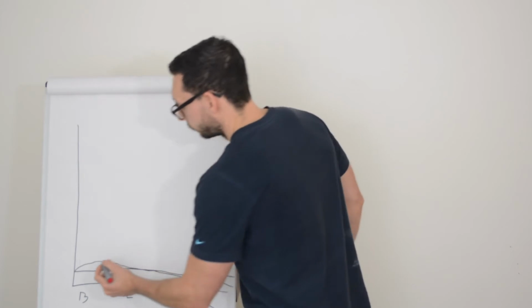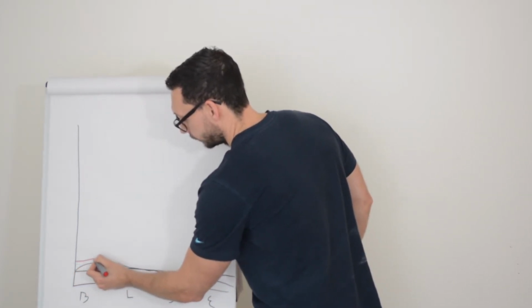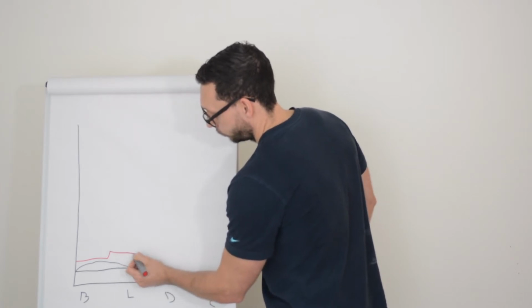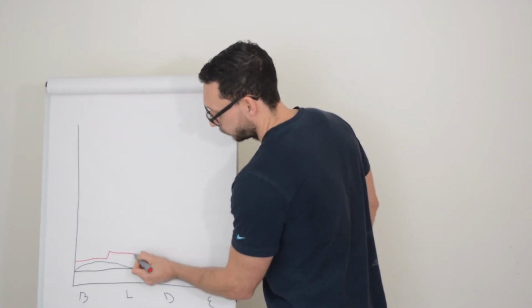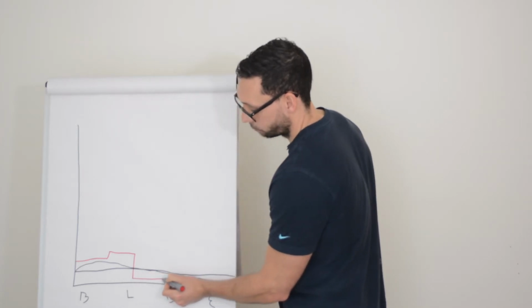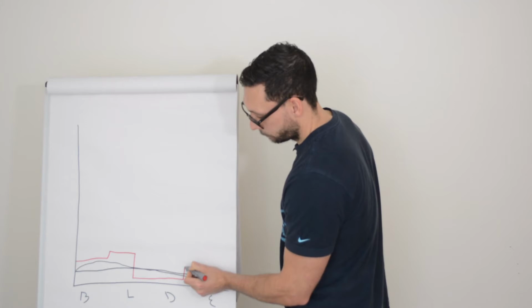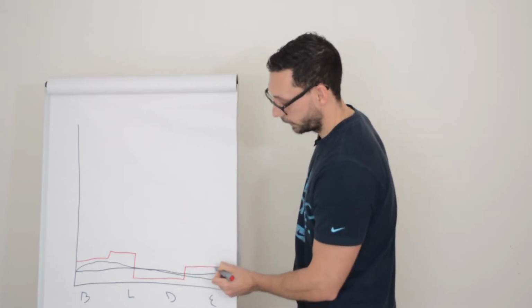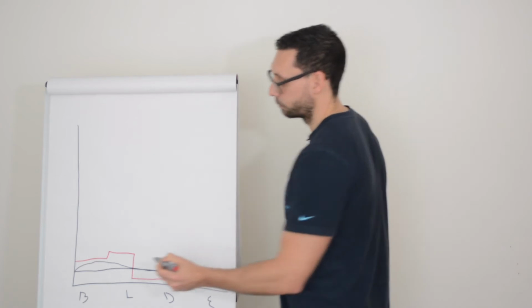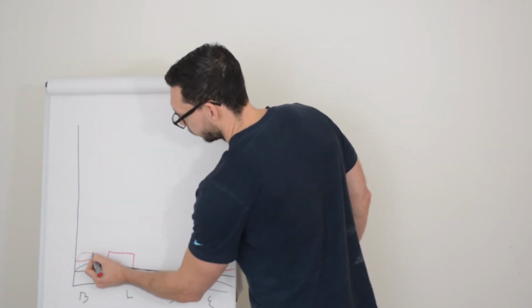Now this gives us some flexibility because what we can do with pump therapy is increase the basal rate when we need to. So let's say you know you're a bit more resistant in the morning after breakfast and then you go for a run. So we can dial that background insulin right down for the run and the prolonged effect of the run. And then we can come back to baseline for the rest of the day. And then overnight, you might have some insulin resistance in the morning due to the dawn phenomenon, so you might even dial it up for a period in the morning.